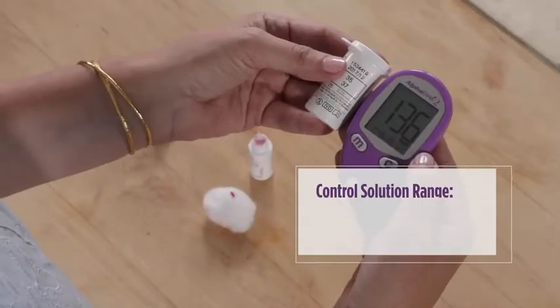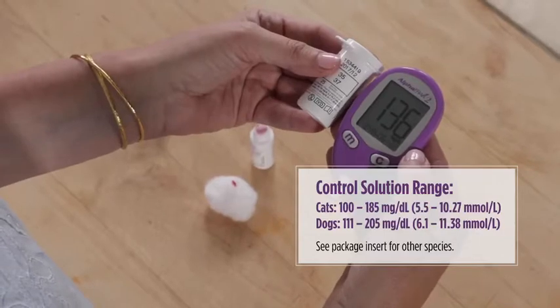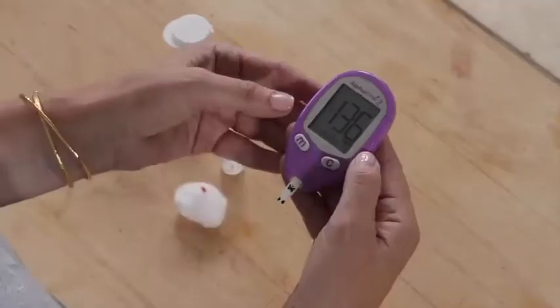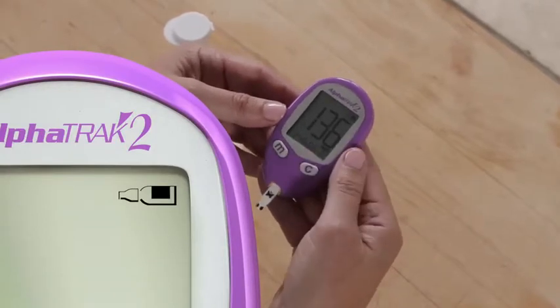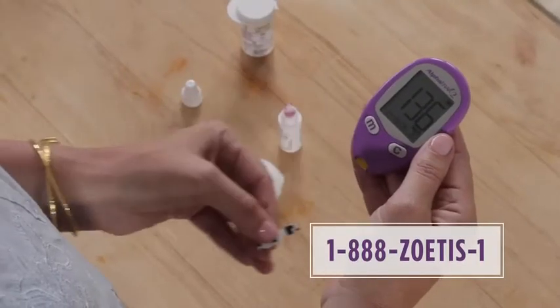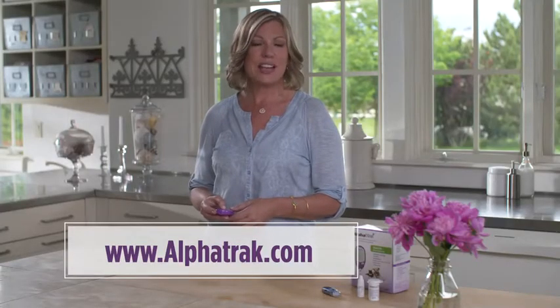Compare the results to the range printed on the test strip vial or on the package insert — it should fall within that range. Press and hold the C button for 2 seconds until this symbol appears on the display to mark the results as a control solution result. Remove the strip to turn the meter off. Your AlphaTrap2 blood glucose monitoring system is now ready to use.